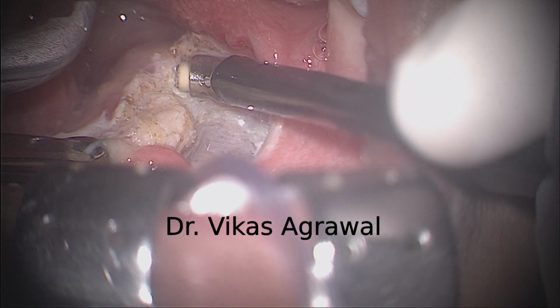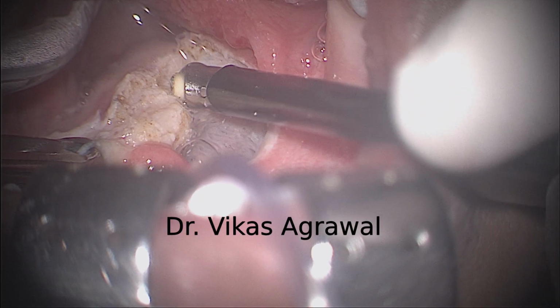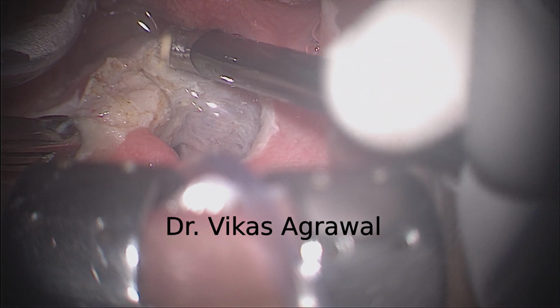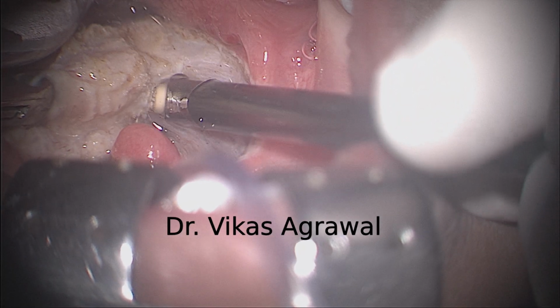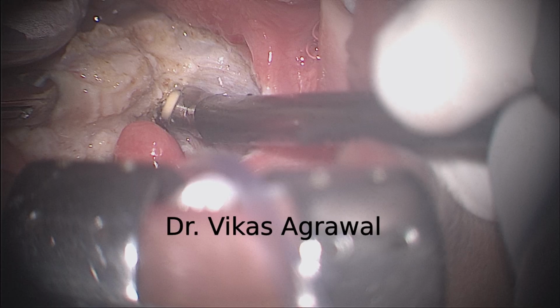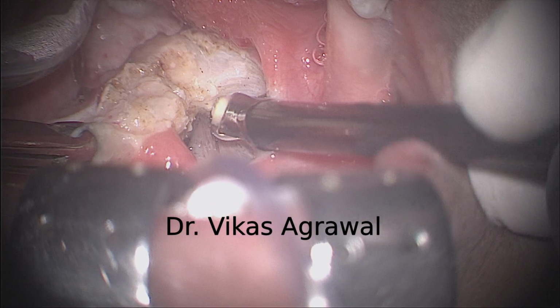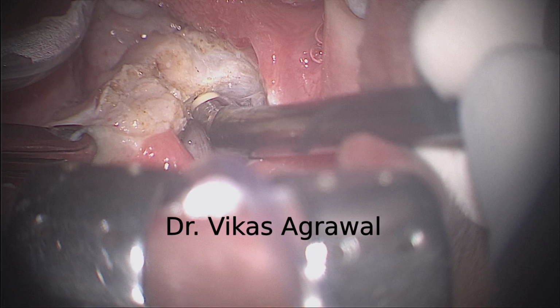And here I might go a little intracapsular. Can you see this? Now I'm going a little intracapsular, not leaving behind too much of lymphoid tissue. I'm going a little intracapsular so that I do not damage the tonsillar artery. That's called hybrid tonsillectomy, my concept, which I'm doing for the last 10 years. This is the little bit of lymphoid tissue, again coagulate along the course of the tonsillar artery.